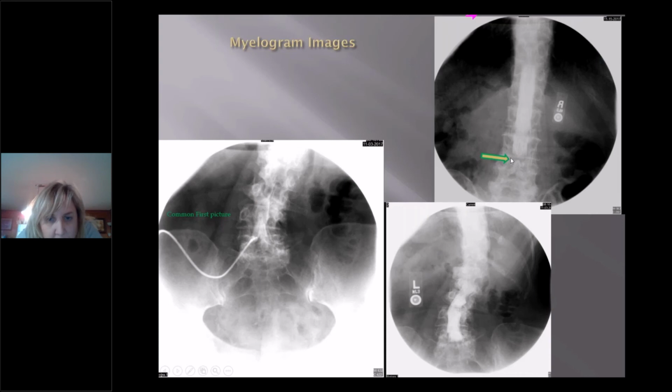We call that dye amputation. And we know just at that picture there's something significant narrowing the spinal canal. In all probability, it's stenosis, but we don't know if it's degenerative stenosis or from a herniated disc or what have you. But what we do know is something is really causing substantial compression at that area.